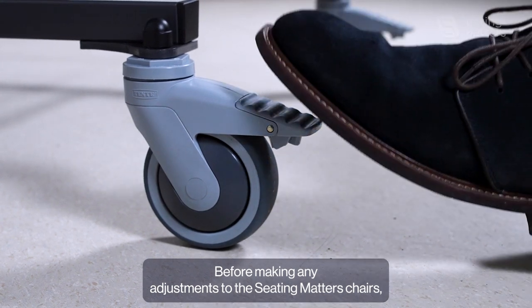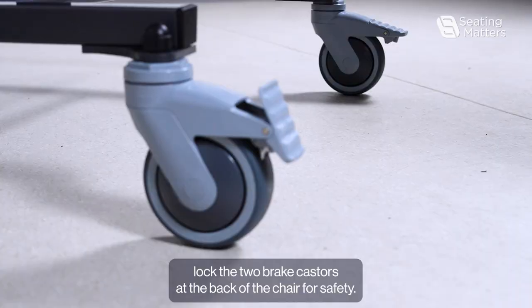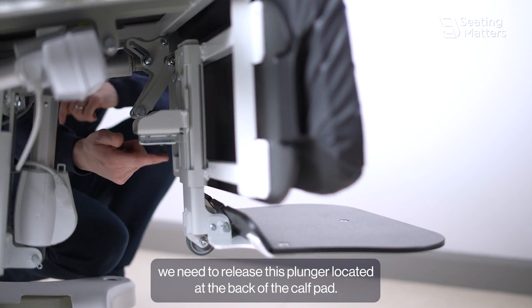Before making any adjustments to the Seating Matters chairs, lock the two brake casters at the back of the chair for safety. To adjust the footrest height on a Sydney, we need to release this plunger located at the back of the calf pad.